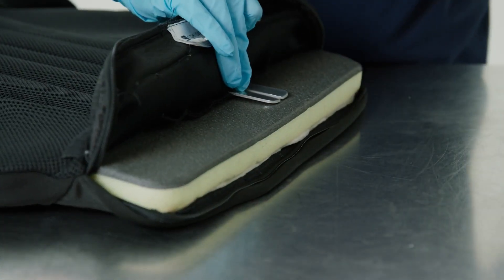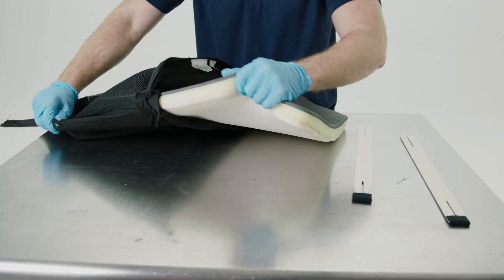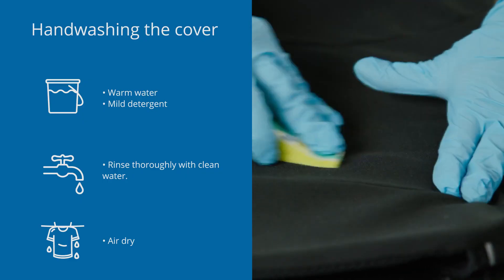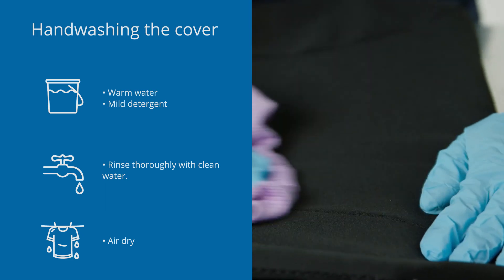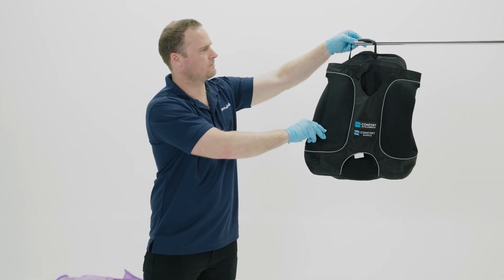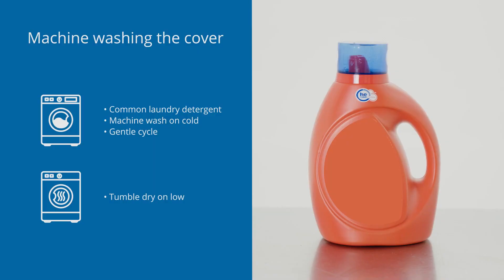For cleaning the cover, remove inserts from the cover first, and hand wash in warm water with mild soap. Rinse thoroughly with clean water and air dry completely before use. Alternatively, machine wash the cover in warm water with common laundry detergent and tumble dry on low.